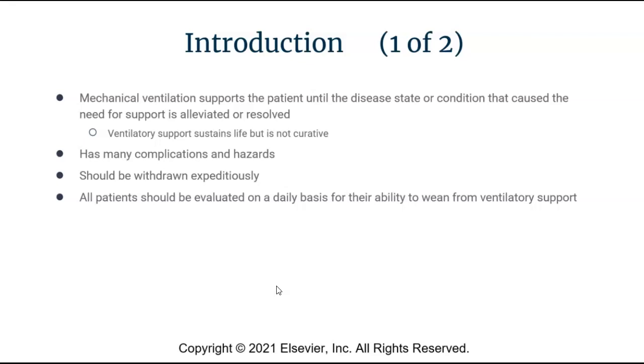With that in mind, every single patient that you see in the hospital, you should be constantly evaluating for their ability to wean off that support. Every single time I go into a patient's room, I should be thinking about trying to wean something. Every time I see a patient, I'm going to be assessing to see if they can wean their oxygen needs, wean their PEEP, wean them off the machine so that we can get the tube out as quickly and safely as possible.